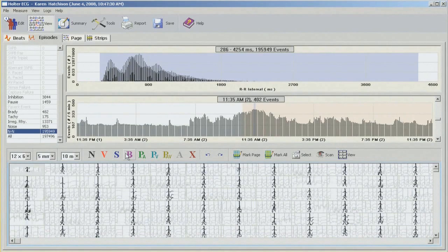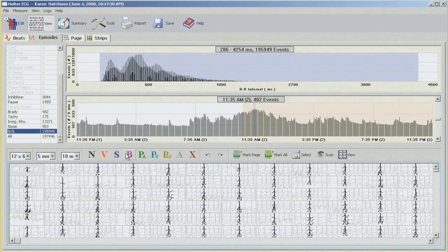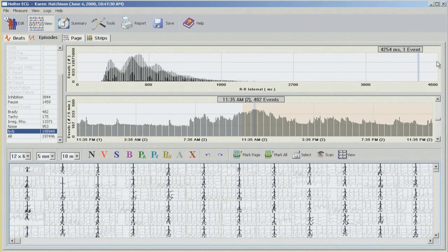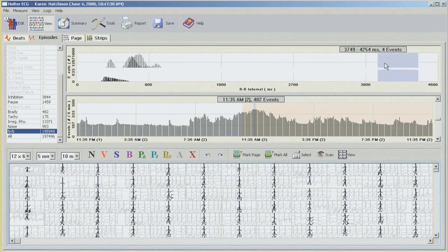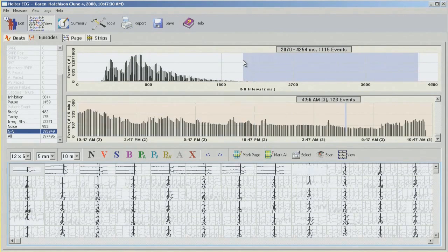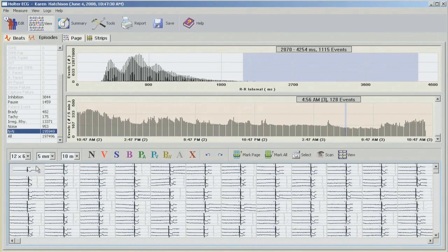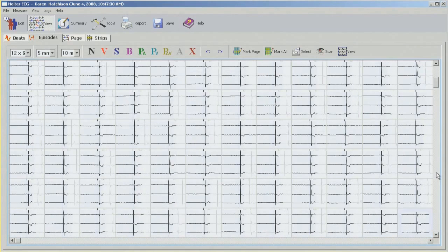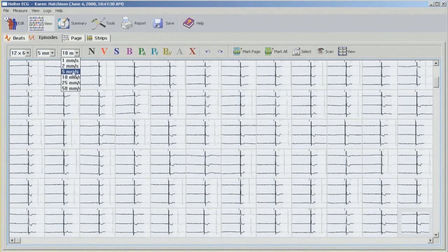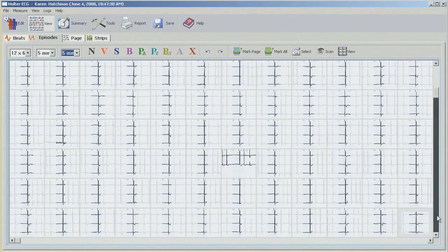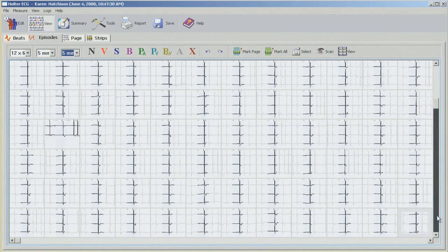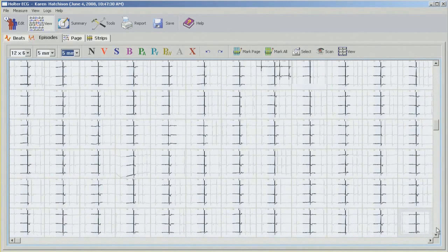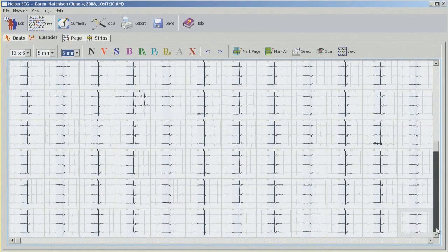So I'm just going to move on to finding our longest and shortest NN. Now for the longest one, I'm going to click the left mouse key, hold it down as far right on this graph as I can, and drag it over until I have about 1000 episodes or so. And I can quickly scroll through. It may be useful to change the time, change the speed rather, so I can see the beats in front of those that I'm looking at.